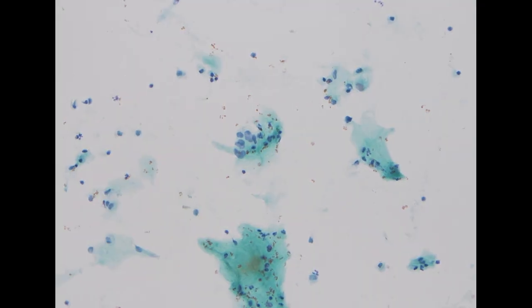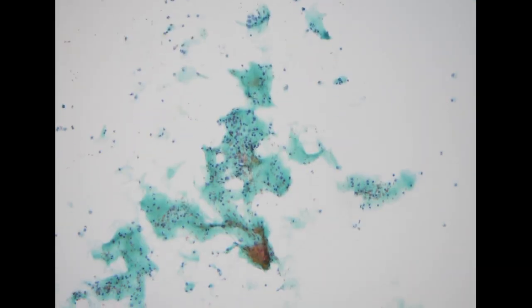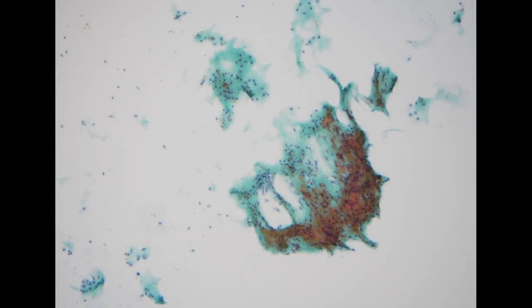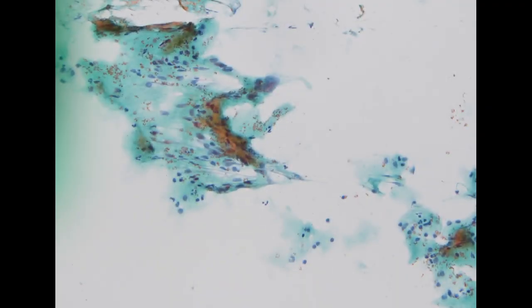Due to the history of pancreas cancer, I think the specimen is suspicious for adenocarcinoma. So I would say it is not easy. The screener has started a couple, but not as prominent as the last one. But here is also an atypical cell cluster.